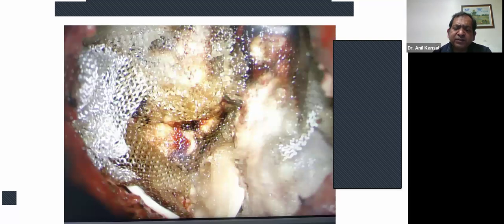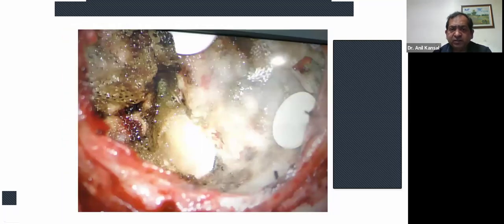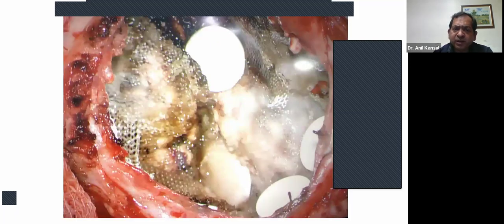After removing the tumor, we have put Surgicel there. Now we'll put the chemotherapeutic wafers, so they can release the chemotherapy directly in the tumor bed. So it prevents the recurrence of the tumors. It can delay the recurrence of tumors, maybe more than 12 months.